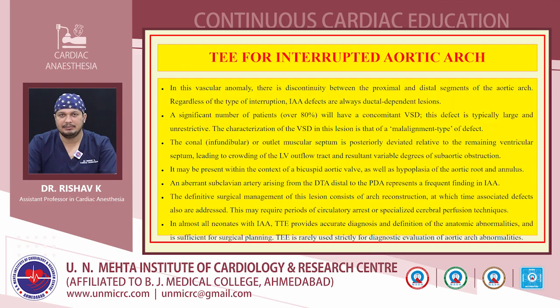The definitive surgical management of the lesion consists of arch reconstruction, at which time associated defects are also addressed. This may require periods of circulatory arrest or specialized cerebral perfusion techniques. In almost all neonates with IAA, TTE provides accurate diagnosis and definition of the anatomic abnormalities and is sufficient for surgical planning. Transesophageal echocardiography is rarely used strictly for diagnostic evaluation of aortic arch abnormalities.